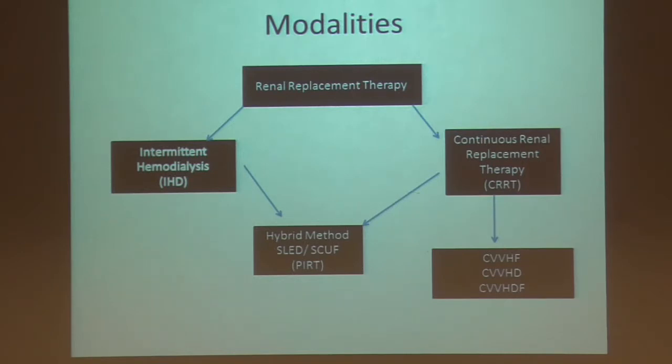The way you come up with that is your blood flows on SLED will be about 100 to 200 ml a minute. So that is just the same treatment, slower. Same machine, slower. Same type of bags. That's why you see the same jugs, but slower. Now, obviously, sometimes we can't take patients off at 12 hours for various reasons. Then these machines can run longer. They do run longer. We see them run longer here all the time. But after about 22 hours, we still have to break them down, change the circuits, and then start them back up.